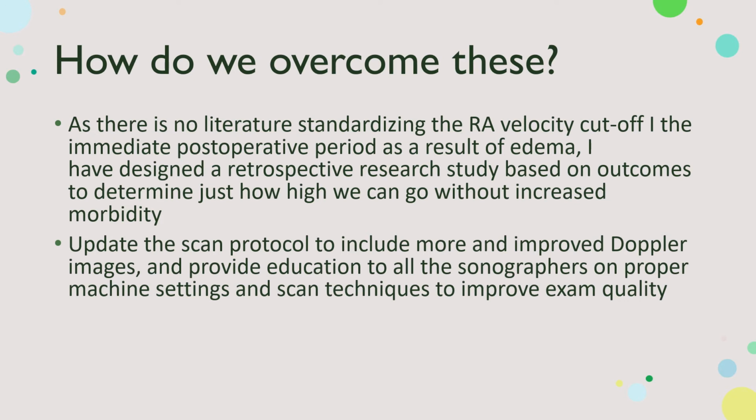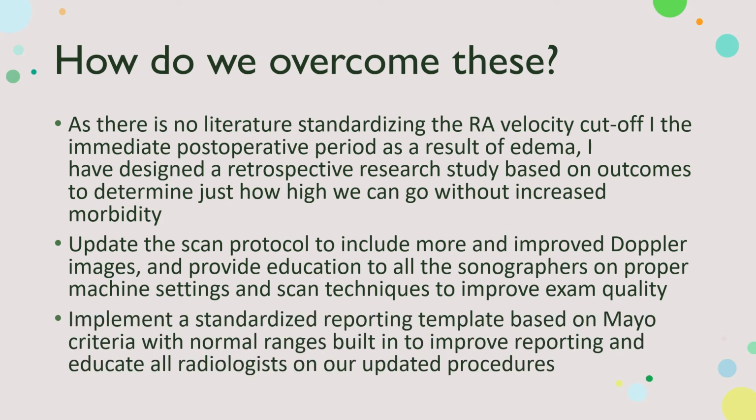So I updated the scan protocol to include more and improved Doppler images, right? And I've already provided the education to the sonographers on proper machine settings and scanning techniques and things we need to do to improve the quality. And then I've implemented a standardized reporting template based on Mayo criteria with everything built in. They're literally just pick lists. You don't even have to think for yourself.